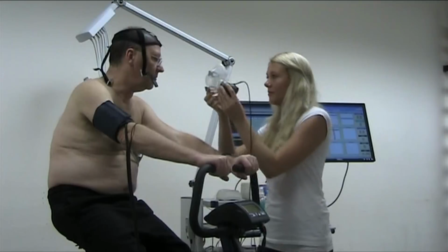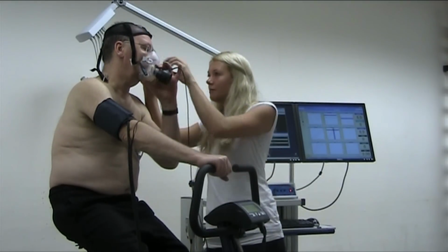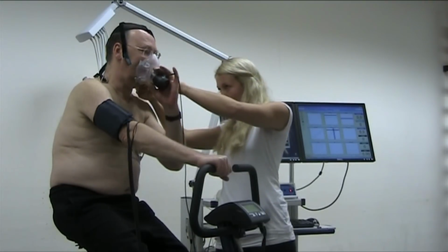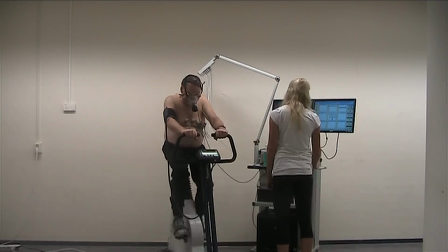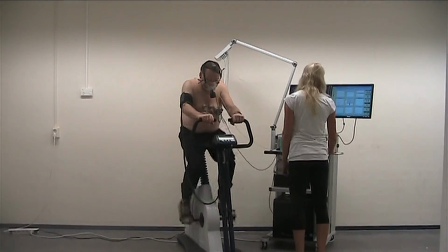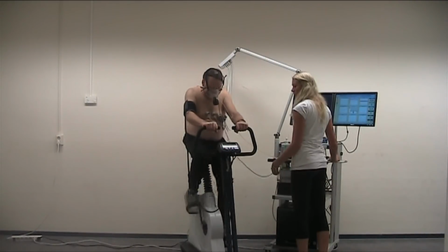When the patient is comfortably seated and the ECG, mask, and blood pressure measurements are applied, the test can start. The patient is asked to keep working up to his max and bike with the same pace and do his best until real exhaustion. The therapist should motivate the patient during the test.